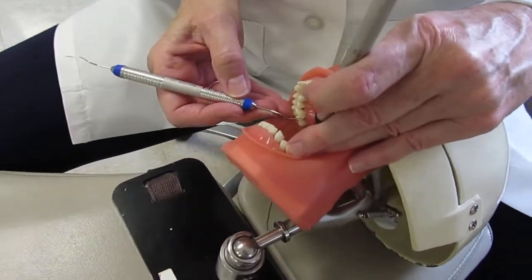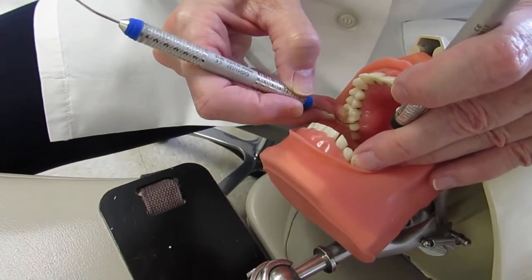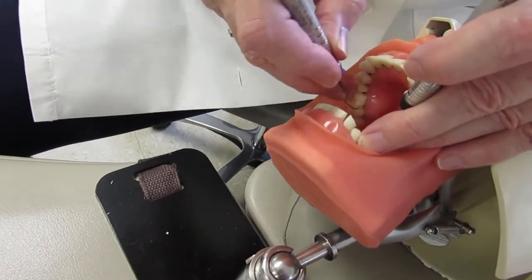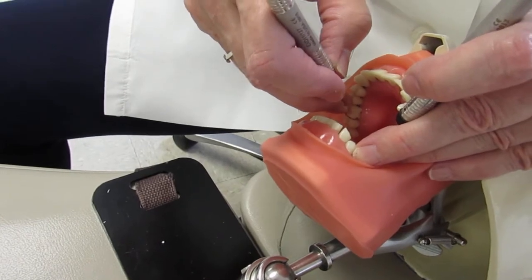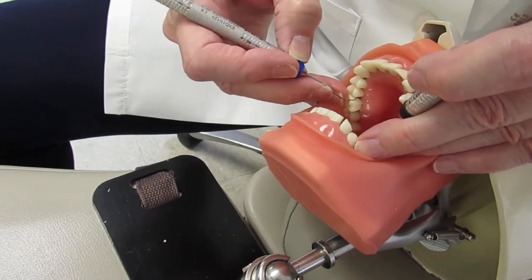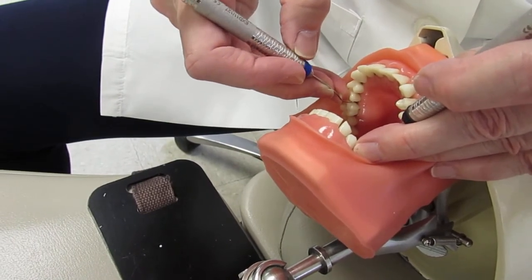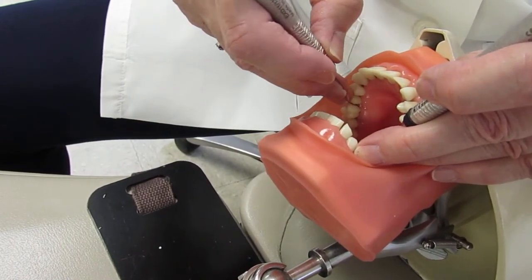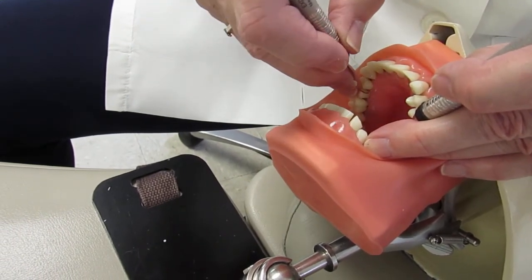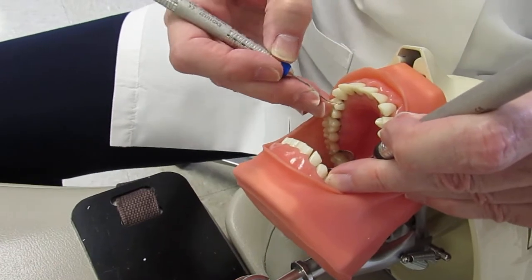Starting on number 3: get ready zone, close, insert, walk and roll. Very short walk on the distal. Then come up a little higher in clock position and walk across that lingual span — it's a fairly long span. Always work in your mirror as much as possible.